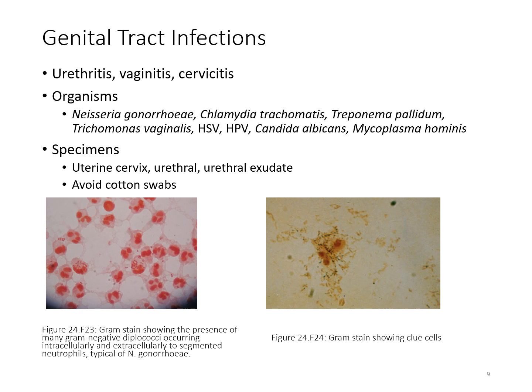We should avoid cotton swabs. Cotton swabs can actually affect the organisms themselves that we typically find in these specimens. So it's usually going to be something like a Dacron swab, or some sort of special collection kit that is used for these specimens.